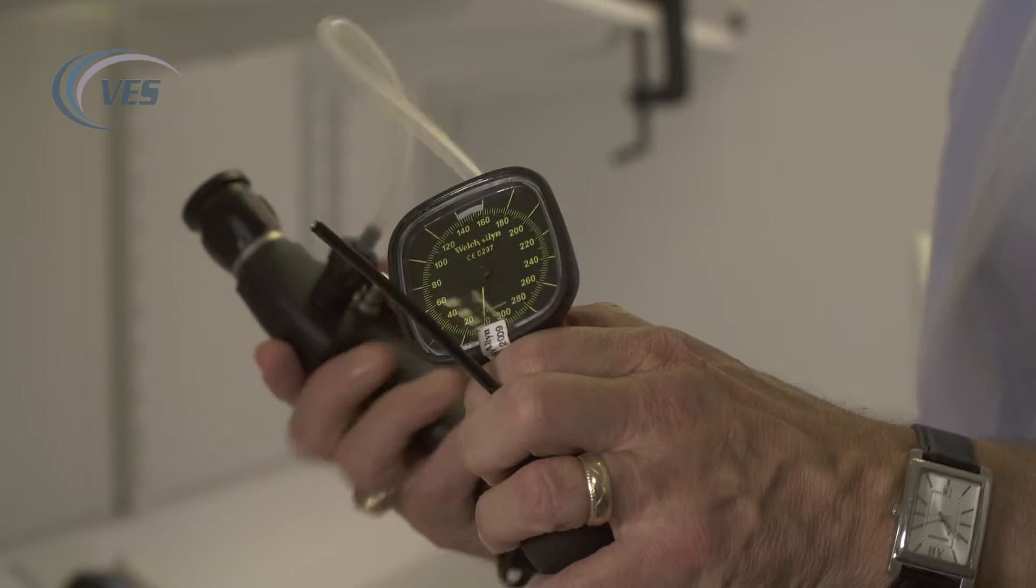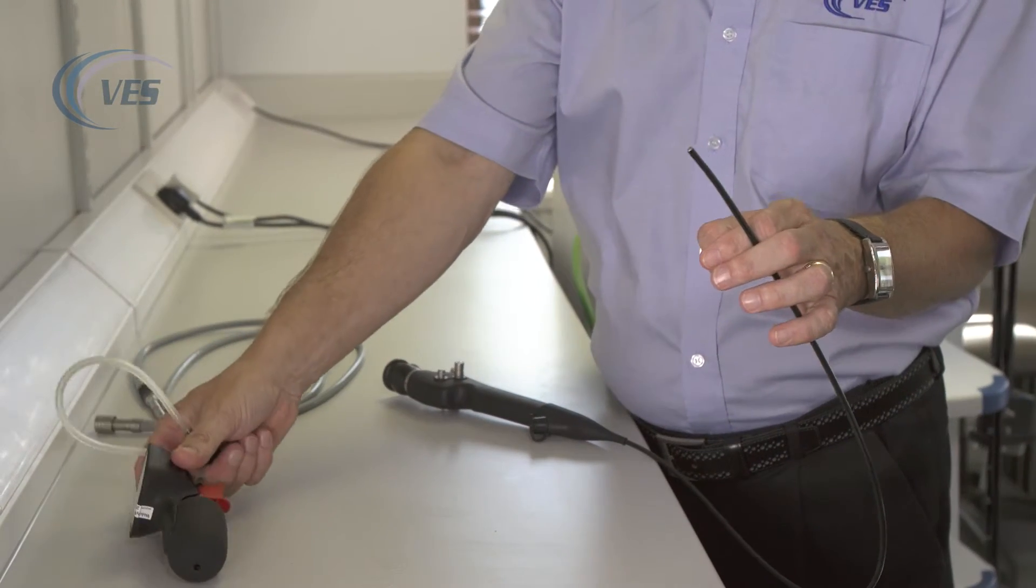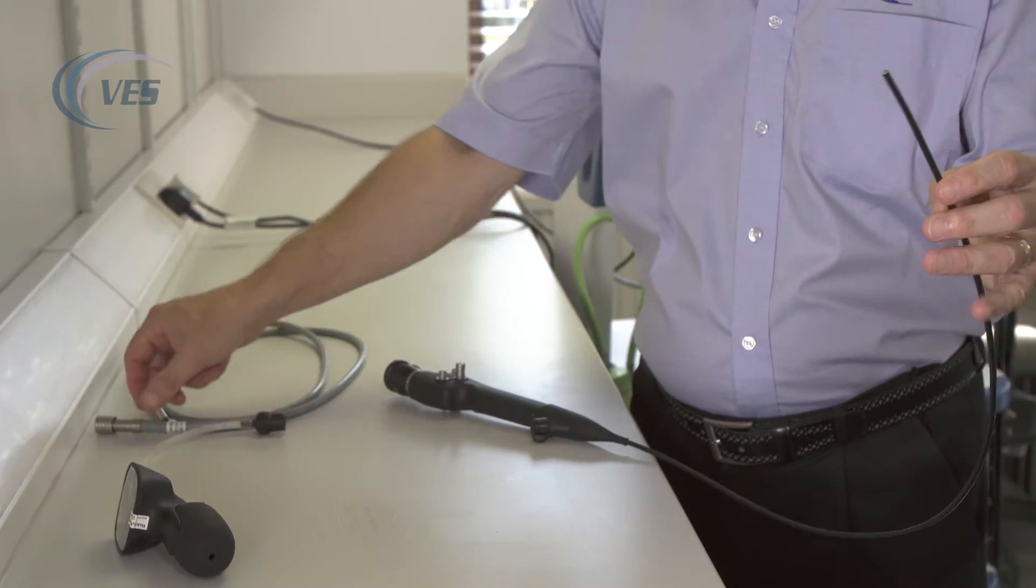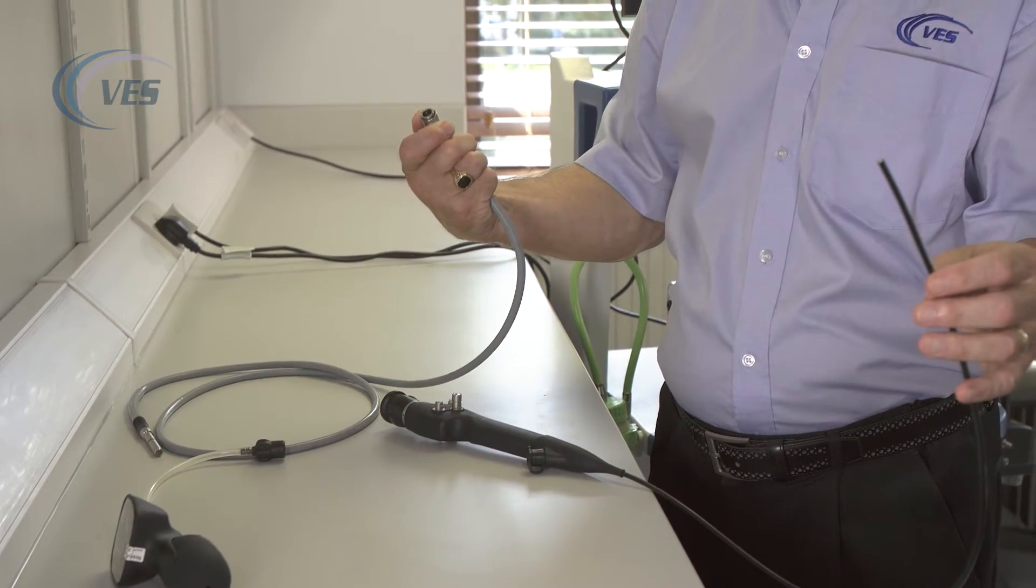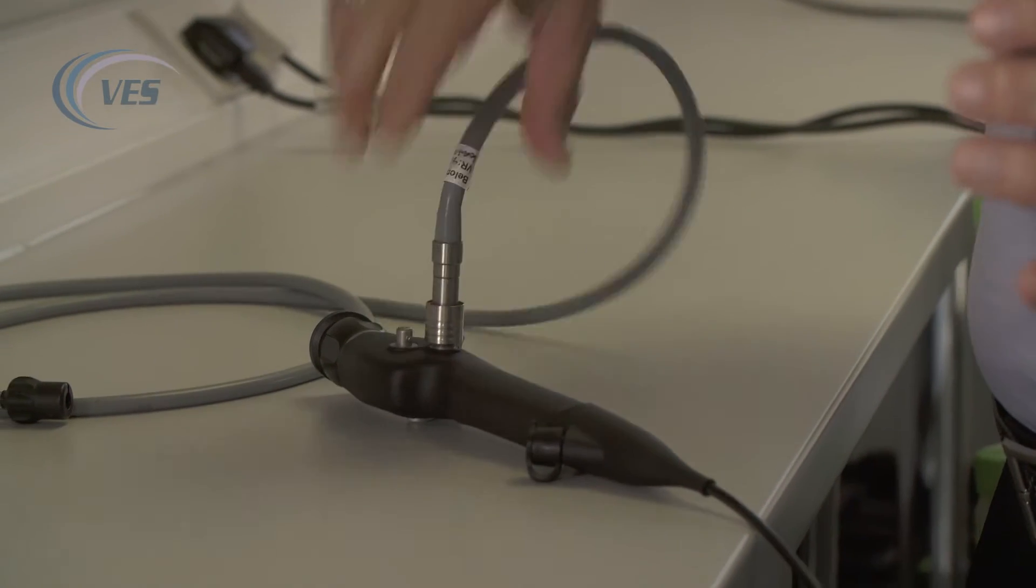What we don't want to do is put a strain on the internal workings of the scope. We then have to attach the light guide cable, which goes onto the side of the post here.